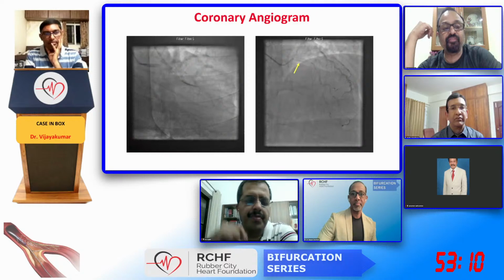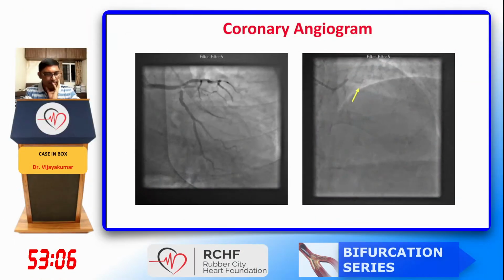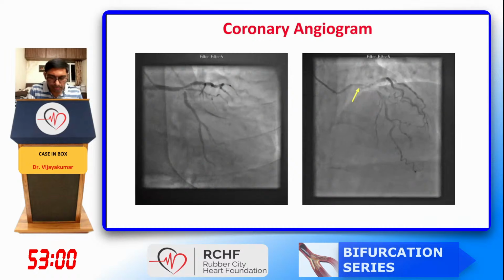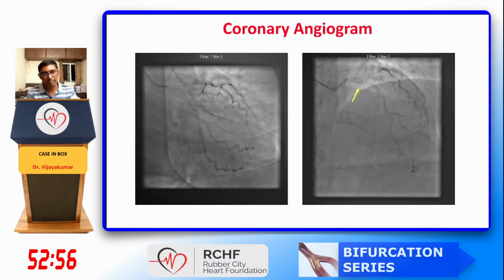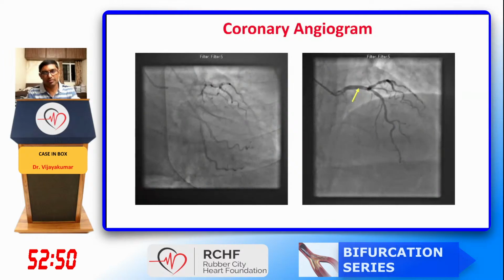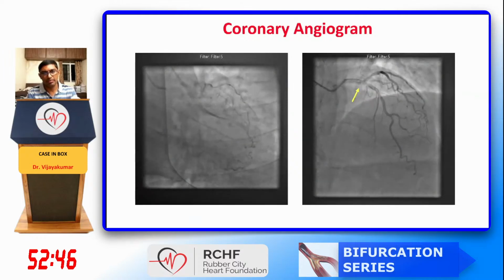ostium. Oftentimes, all my fellow panelists and Dr. Madhu will agree with me that if the job is not properly done, oftentimes these patients come with circumflex ostial disease. So you have to really prepare the ostium of the circumflex with a cutting balloon, if necessary rotablation, have a near stent result even before stenting the ostium of the circumflex, and have an upfront 2-stent strategy in this patient because the circumflex is very, very critical.